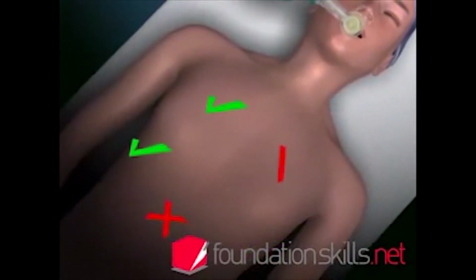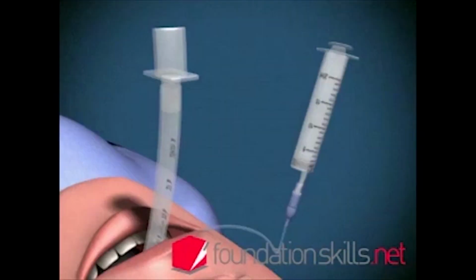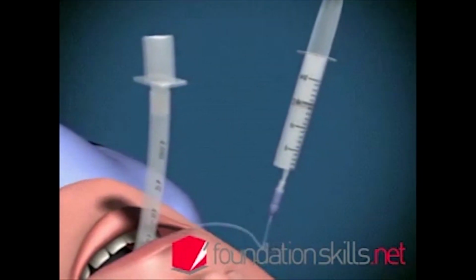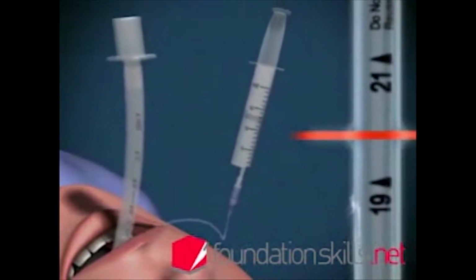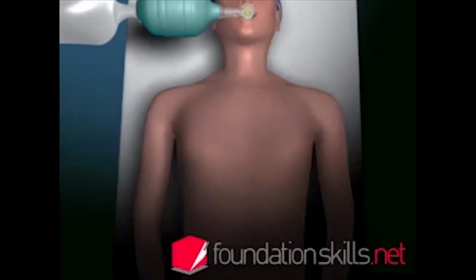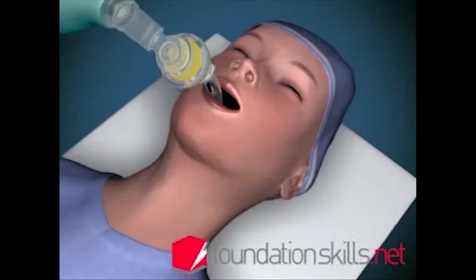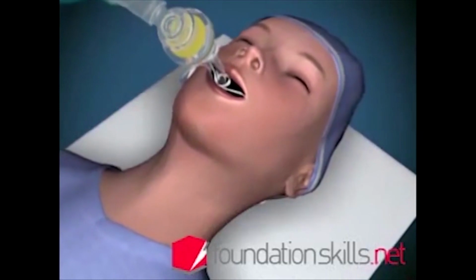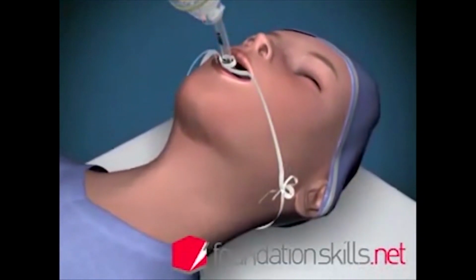If the tube is in too far, the right lung will be ventilated only via the right main bronchus. If this occurs, deflate the cuff and withdraw the tube 2 to 3 centimeters. Re-inflate the cuff and recheck the position. When the tube is in the correct position, tie it in place with cotton tape and attach the tube to the ventilating apparatus and ventilate the patient.